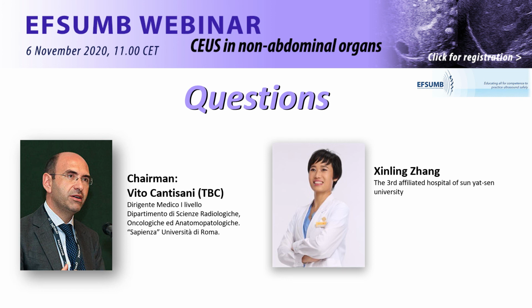Yes. Yeah, I can add something also from my point of view. If you have the double wire, this is incorrect. This is correct. So you have to do it parallel to the main line. This is in order to avoid disruption of the microbubbles.